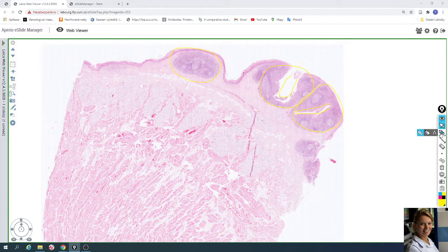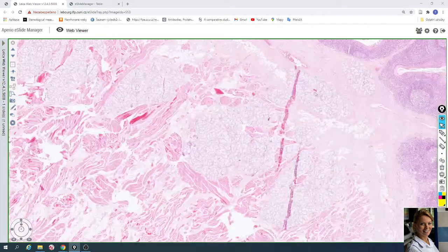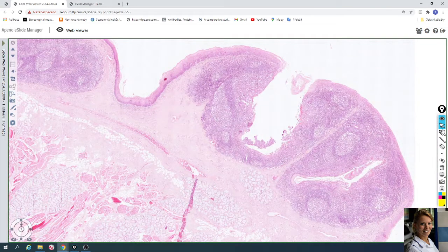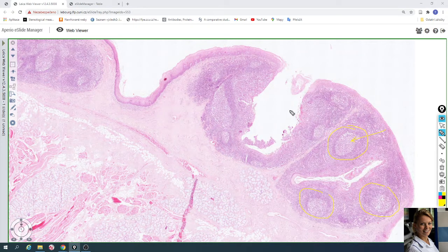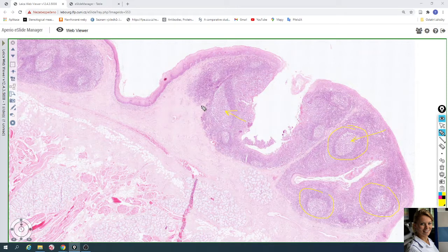The tonsil contains numerous secondary lymphatic follicles or nodules. For example, here is a secondary follicle with a paler germinal center. This is another lymphatic follicle with a paler germinal center, called the secondary lymphatic follicle.